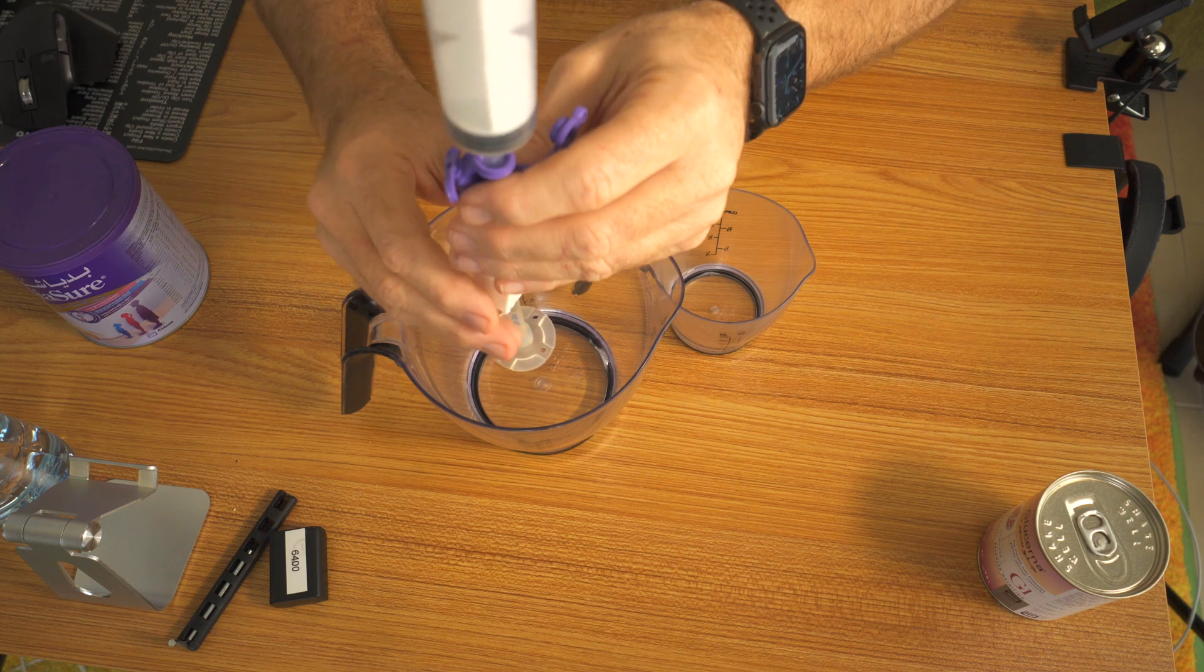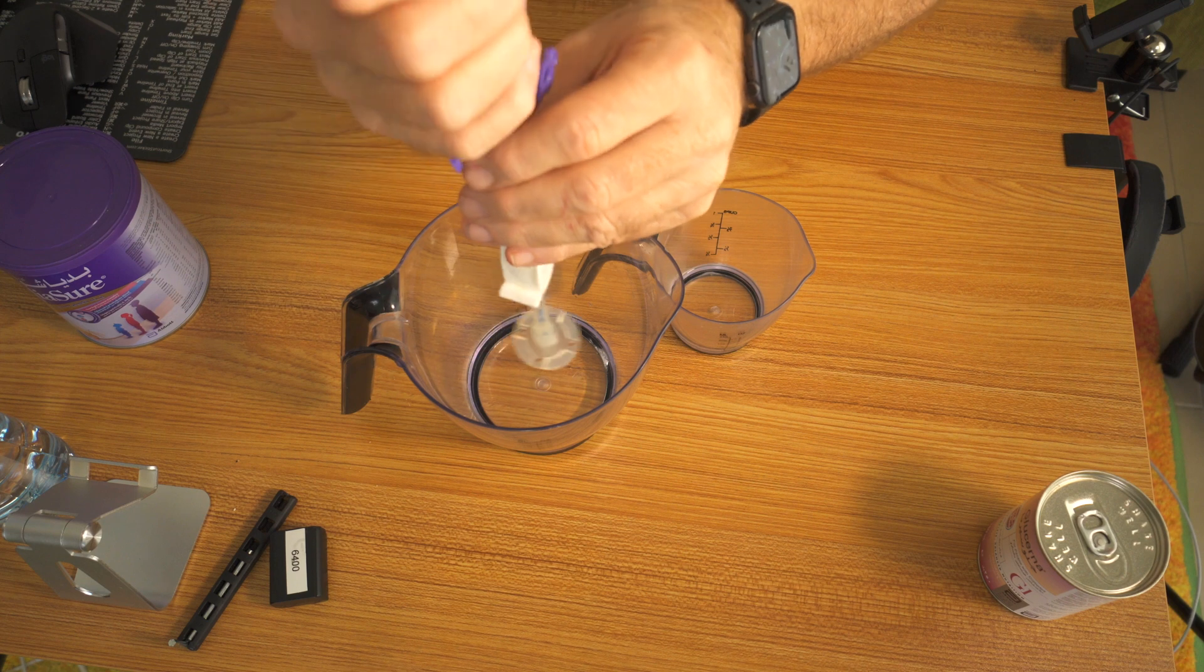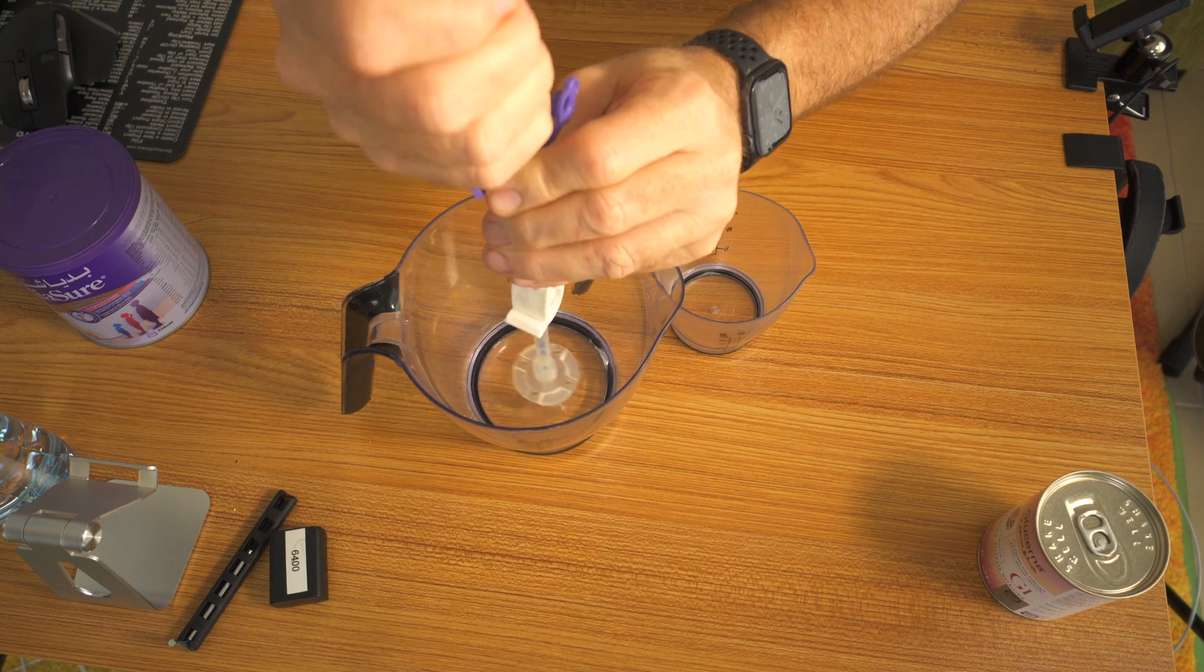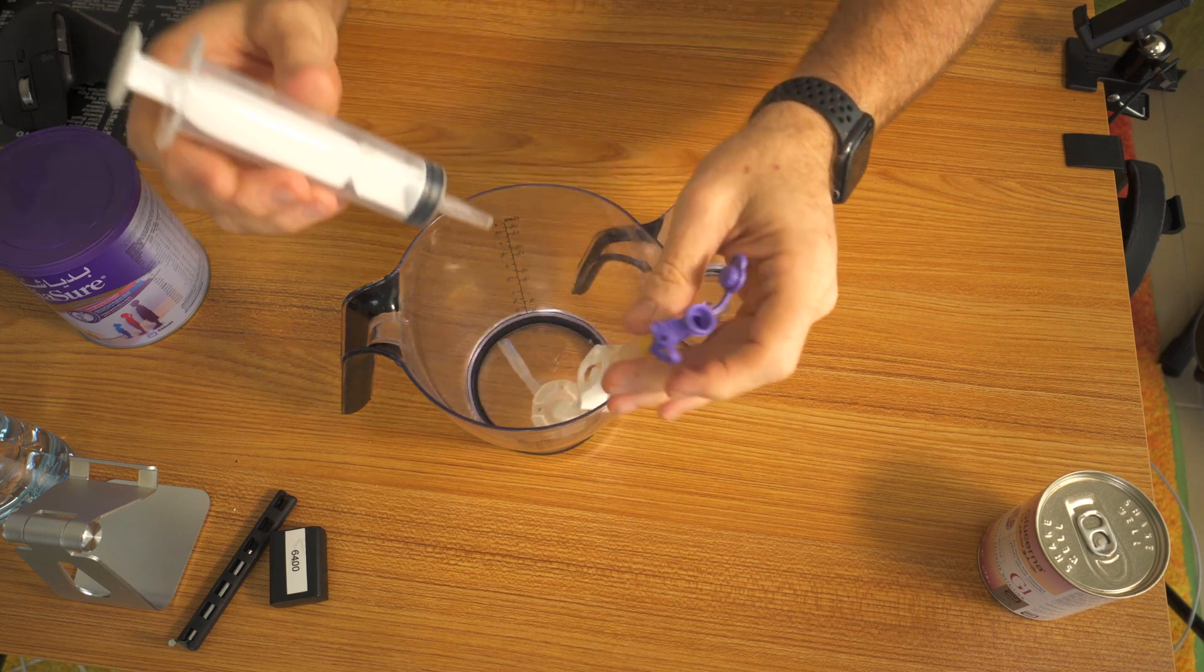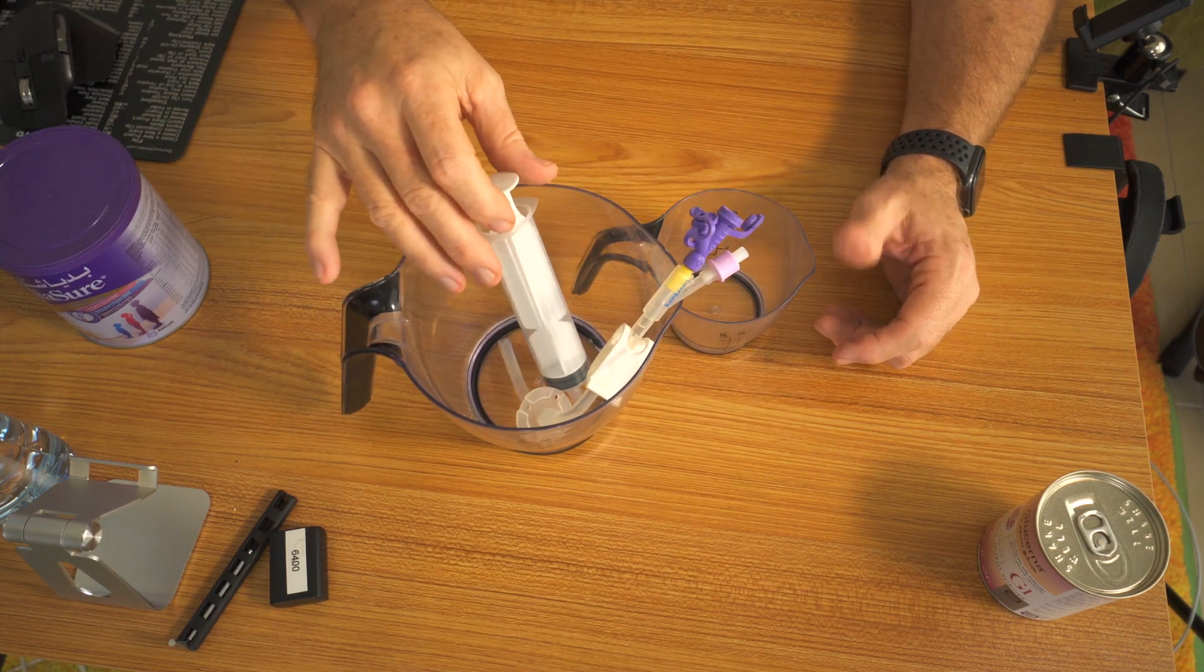This also is helping keep any blockages at the end of the tube from staying in there and interfering with you getting your food in. Now we'll remove the syringe again and set the syringe down.